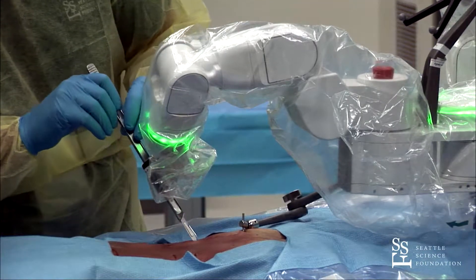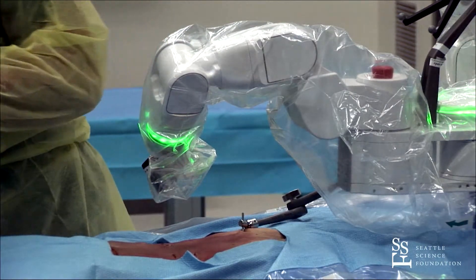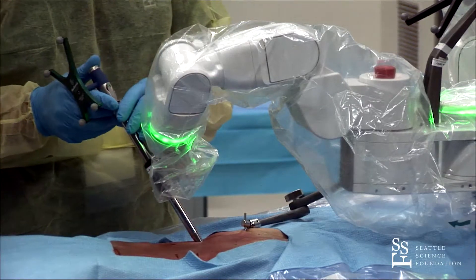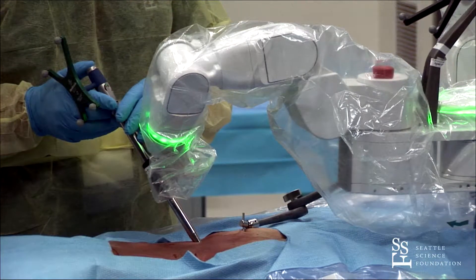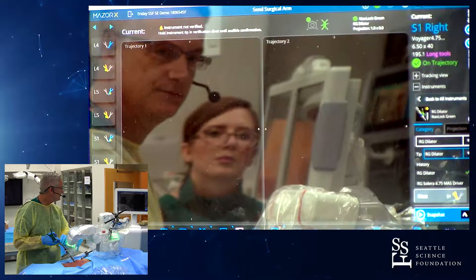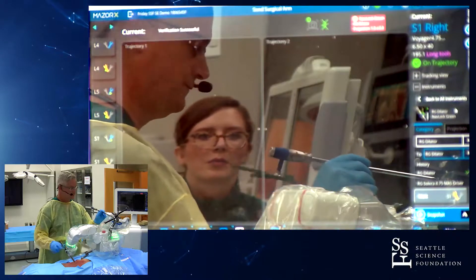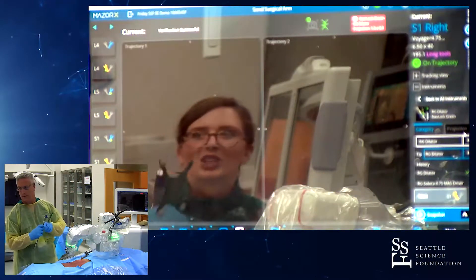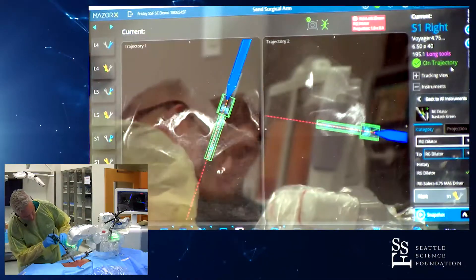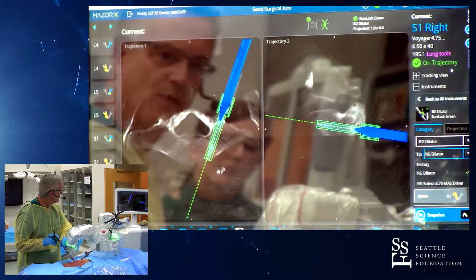I can make my incision and go down to bone. We use our dilator, which is navigated as well. We'll place that on the screen for you and verify that too. You can see our docking point on the screen.